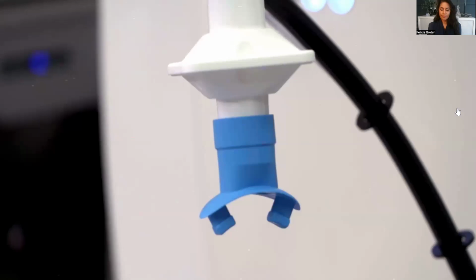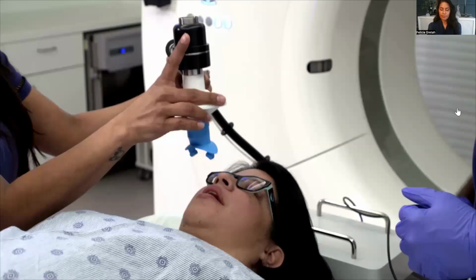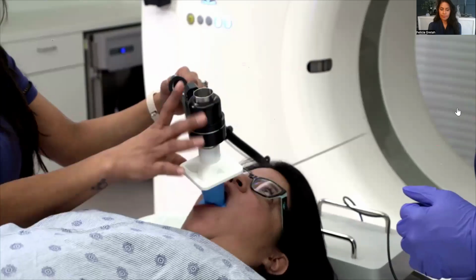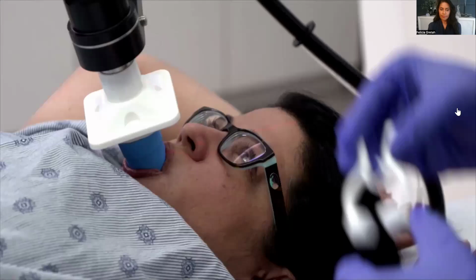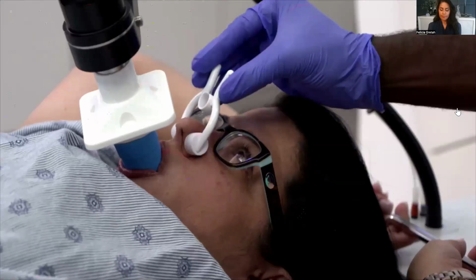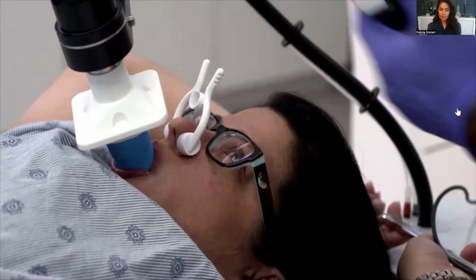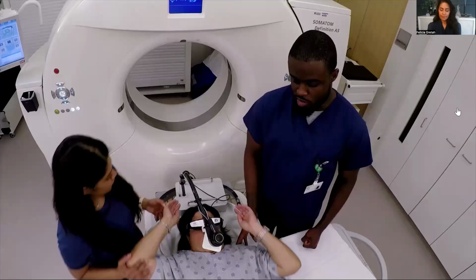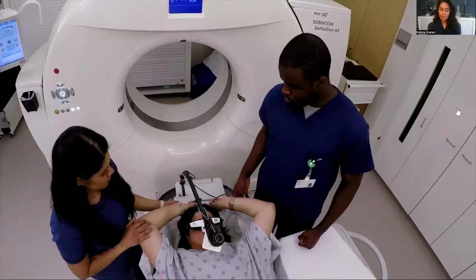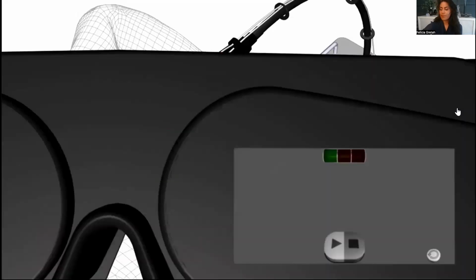A soft, rubber, snorkel-like mouthpiece will be placed in your mouth. Lightly bite the inner plastic tabs and create a tight seal with your lips around the outer portion. Then, a padded nose plug will be placed over your nose to ensure all airflow is occurring only through your mouth. Finally, a pair of video goggles will be placed over your eyes. These goggles will allow you to see a video screen showing your breathing pattern.